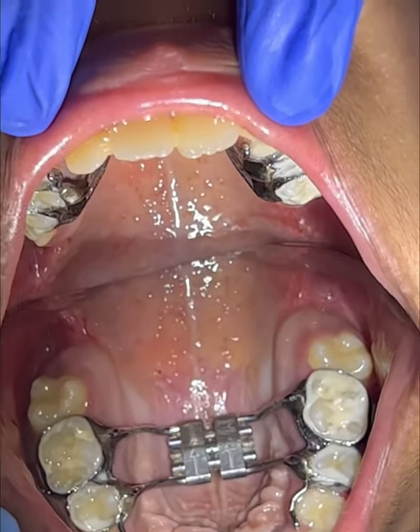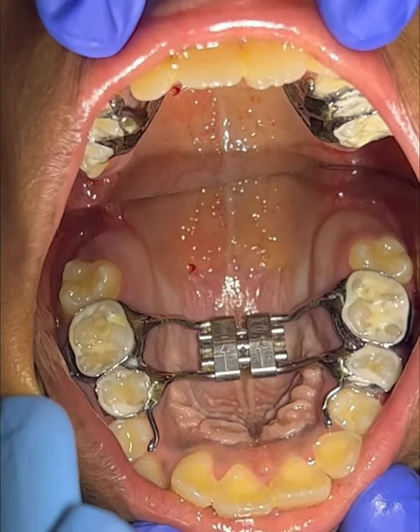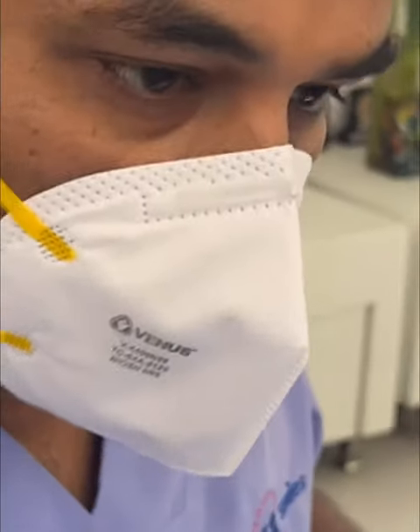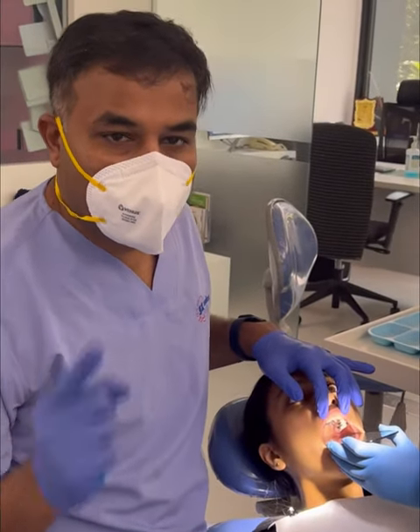This turn should be given every day, once a day at night before the patient goes to bed. When the turn has been done, the patient should note it on a sheet and sign it. A patient should come to see us every 10 turns so that we can verify the turns are happening in the right direction.